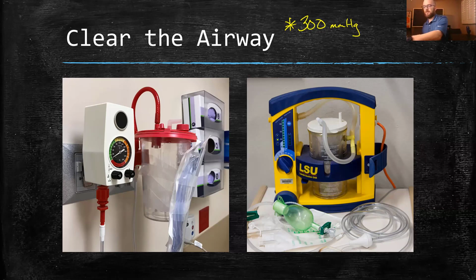More standardly, we'll use these rigid tip catheters. Again, this one's a little bit harder to see, but there's a little port right there that, once you cover it up, suction will actually start on the end. You can suction against your gloved hand just to check it out and feel it. These rigid tips are called tonsil tip catheters or Yankauer. Let me try to write that down. Tonsil tip or Yankauer. I think that spelling is right.